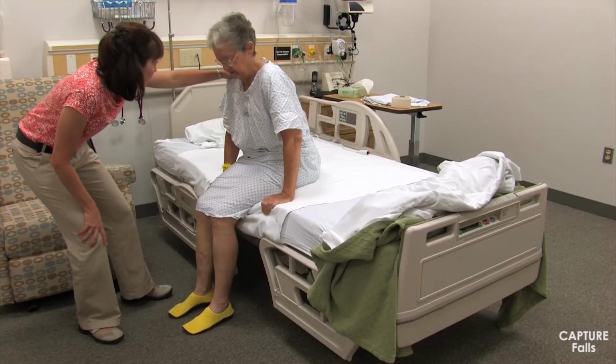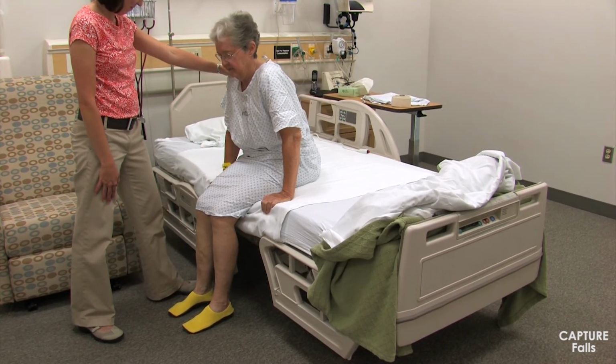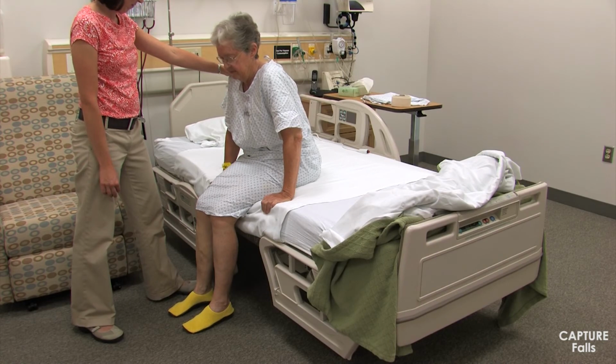Prior to initiating the transfer to the bedside chair, you should assess the patient's potential to tolerate the transfer once you have them sitting at the edge of the bed. It is best to remain close to the patient and even keep a hand on the patient's trunk while they are sitting so that you can feel if they need any assistance with their sitting balance. A patient who is struggling to sit will also have difficulty moving into a bedside chair. You should also be observing the patient for any signs of lightheadedness, since they likely will have just transferred into sitting from supine.